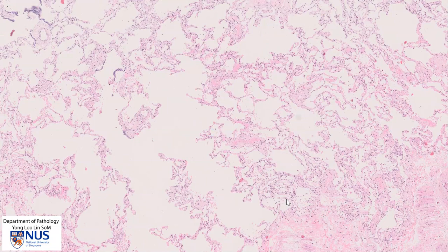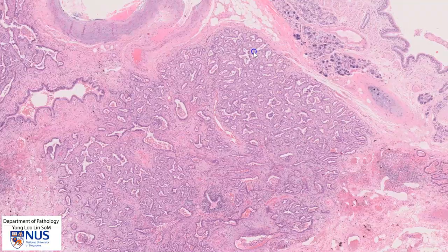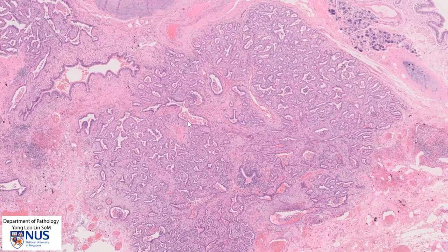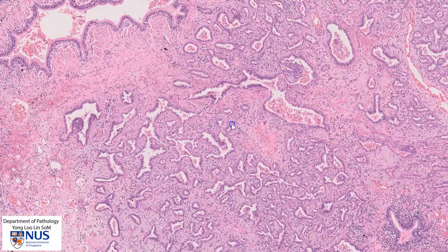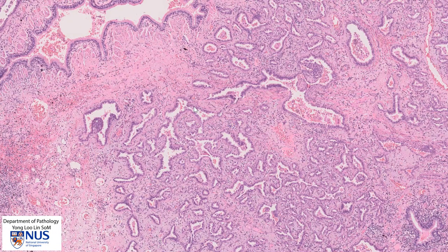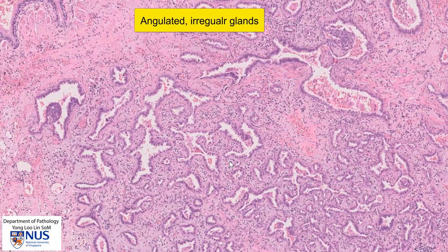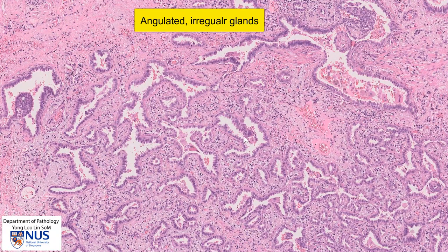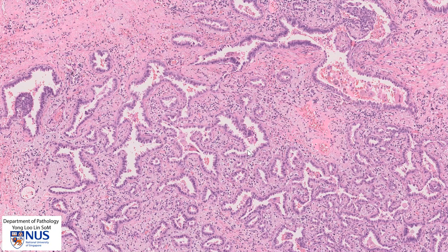Now let's move on to the tumor. At this magnification we can see a lot of irregular, very angulated glandular spaces. Zooming in, you can see how angulated — almost triangular — these irregular glandular spaces are. We can still appreciate that they are forming glands; however, these glands are extremely irregular, which is a very atypical architectural feature. There is also a lot of broad stroma in between these glands, unlike the alveolar septa which have hardly any stroma at all.